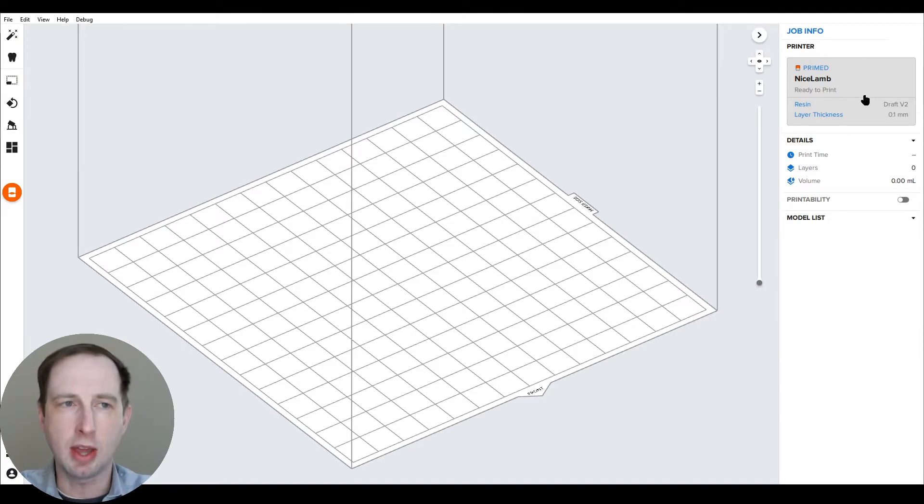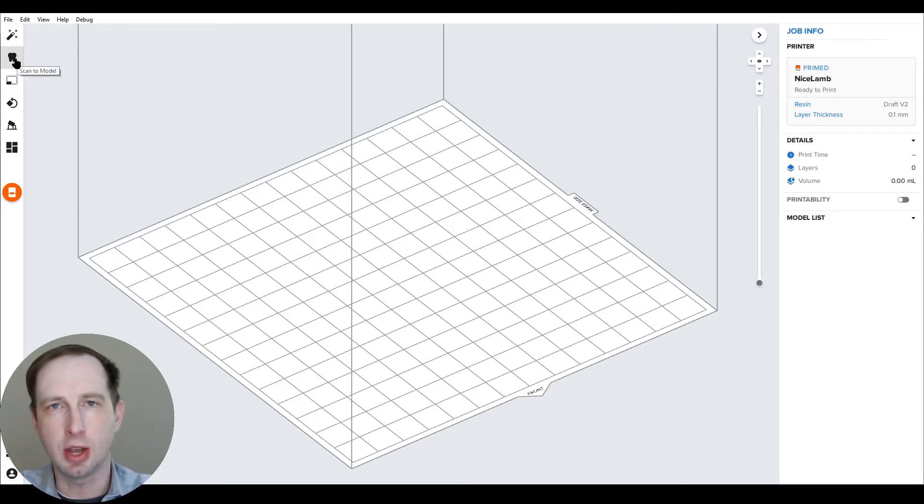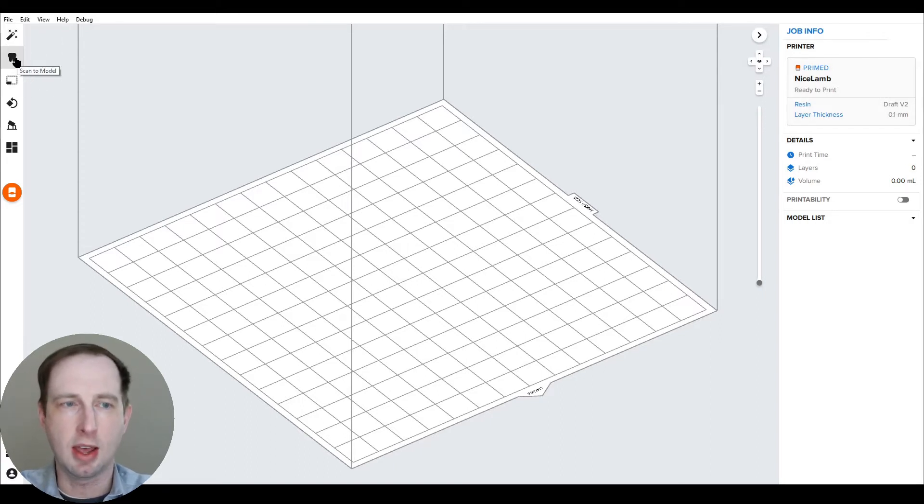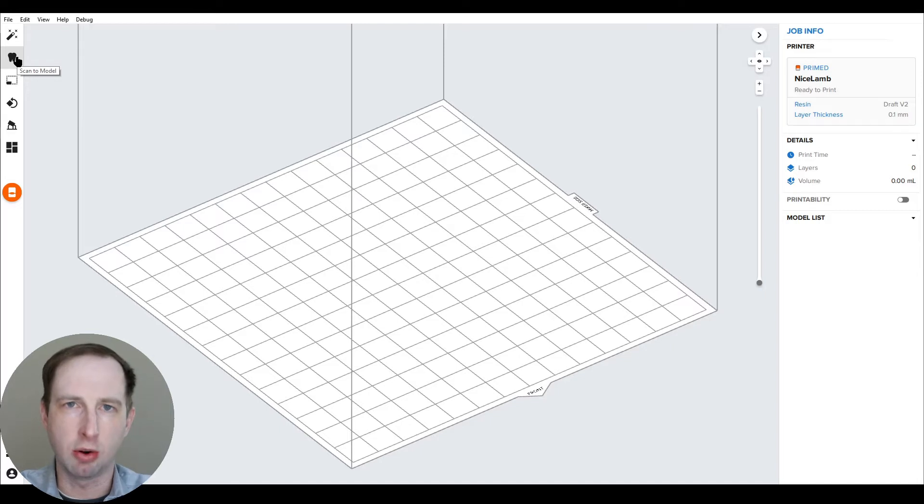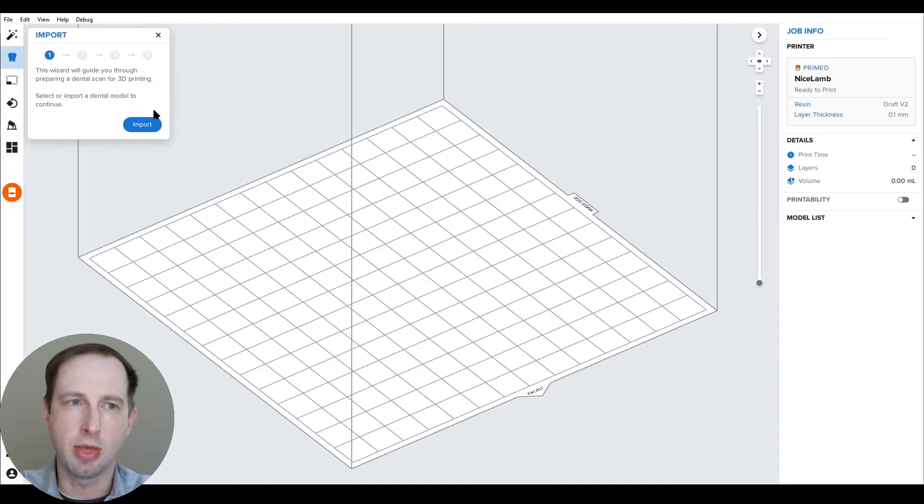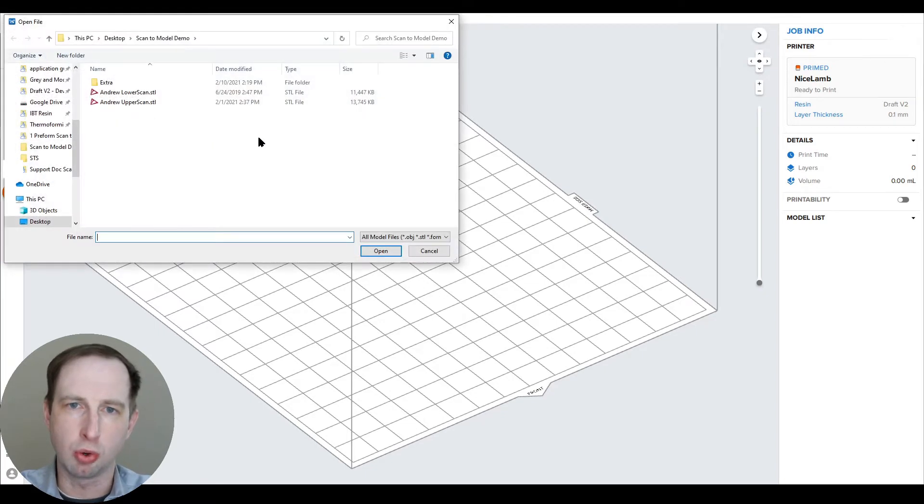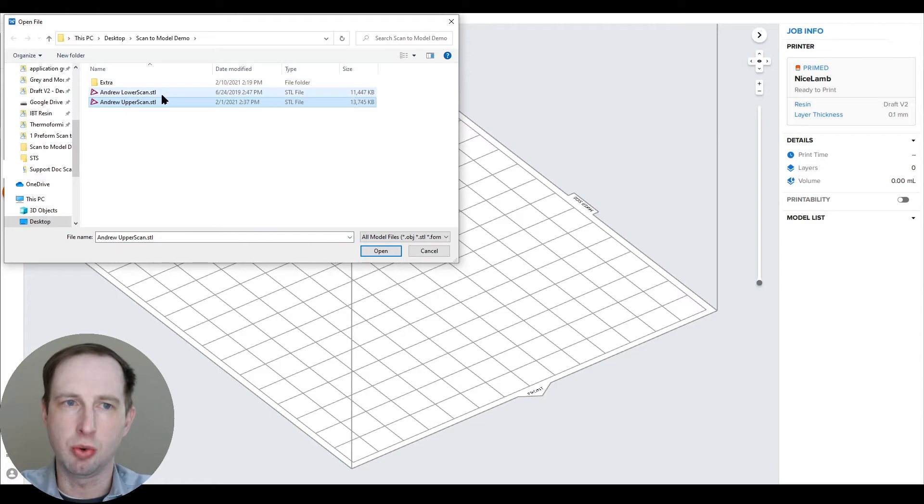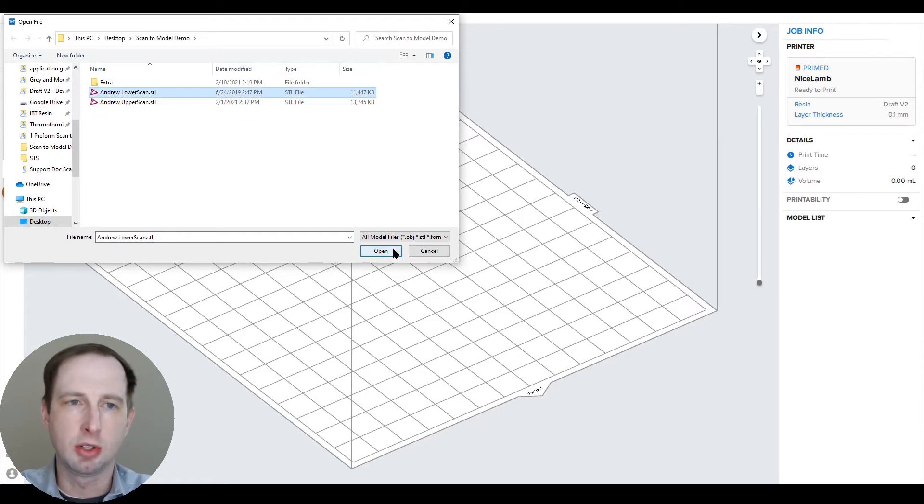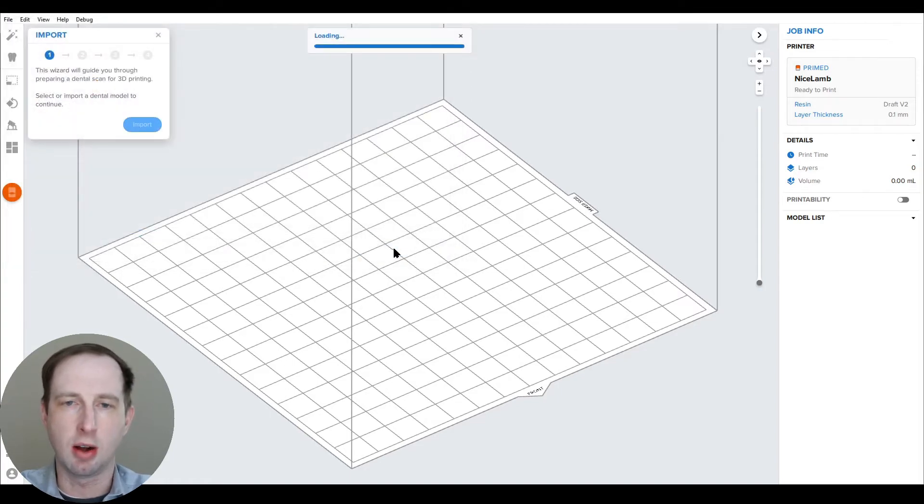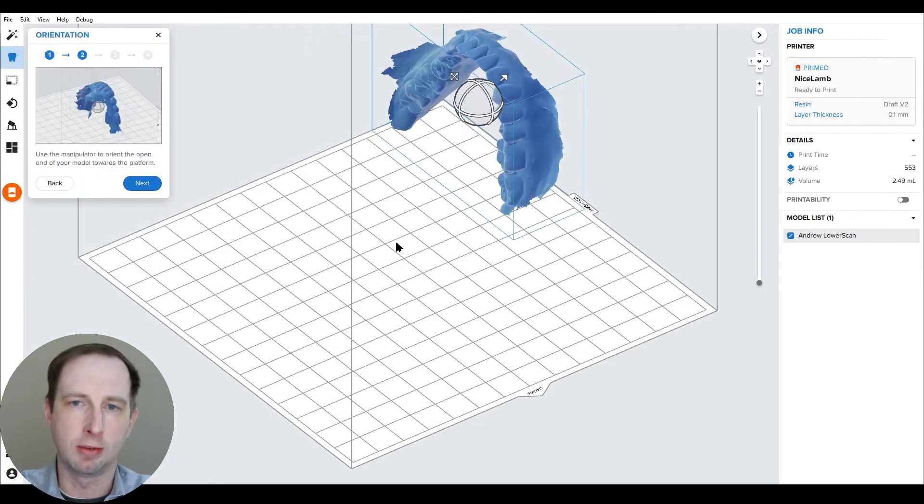With that done, on the left hand side you'll see a tooth icon has now appeared. This is Scan to Model. So the workflow is relatively straightforward. You click on this icon, it allows you to import your scan. For this one, I'm going to show you Andrew's scan and how to build it. So we're going to take his lower first.